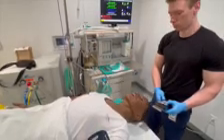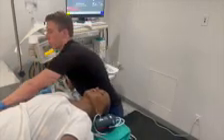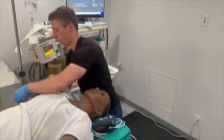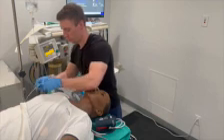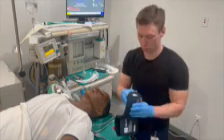Once patient position and bed height are established, it is then time to place all of the appropriate monitors. This will include the pulse oximeter first. For expedience, many providers then place the blood pressure cuff, and while blood pressure is being obtained, they place the 5 leads for the electrocardiogram. We will obtain baseline vital signs and pre-oxygenate.